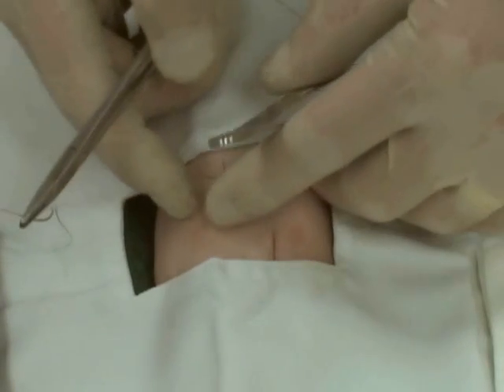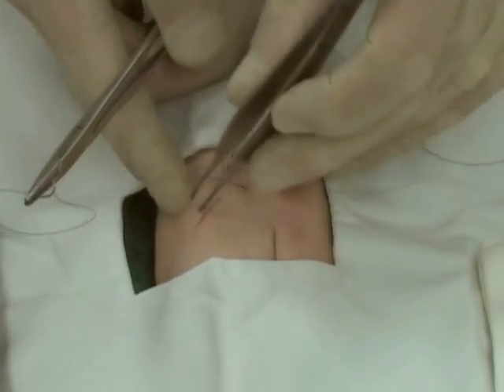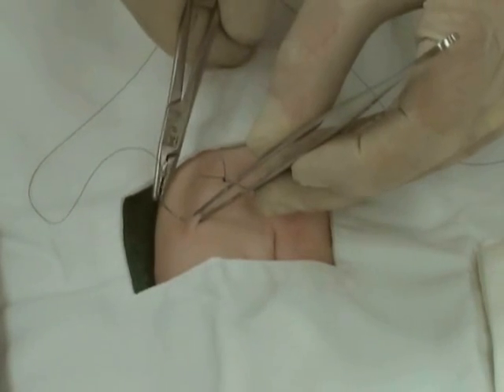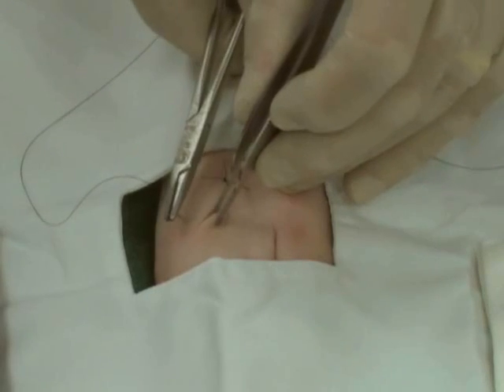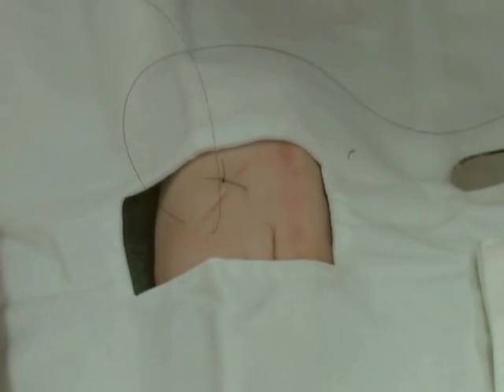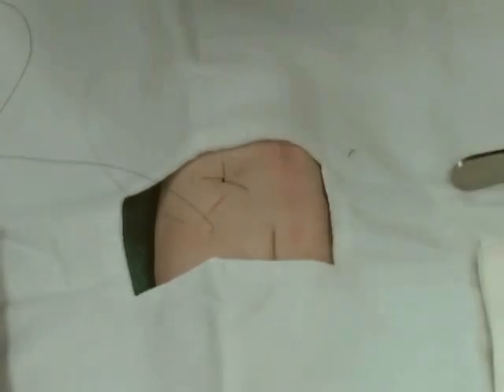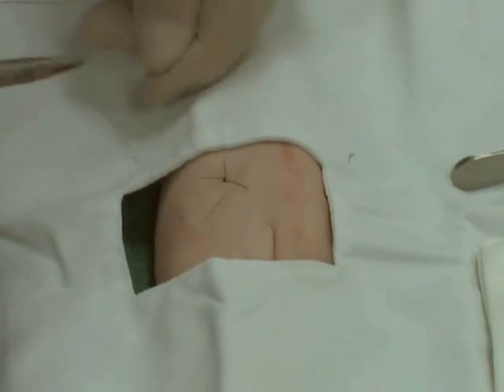First, we'll demonstrate the length of the incision. We're dividing in half to avoid dog ears. Place the needle at a 90-degree angle. Use your wrist to turn the needle through. Hold the end of the suture so as not to pull it through, and leave a tail long enough for tying the suture. Place the instrument between the two sutures and throw twice for a surgeon's knot.